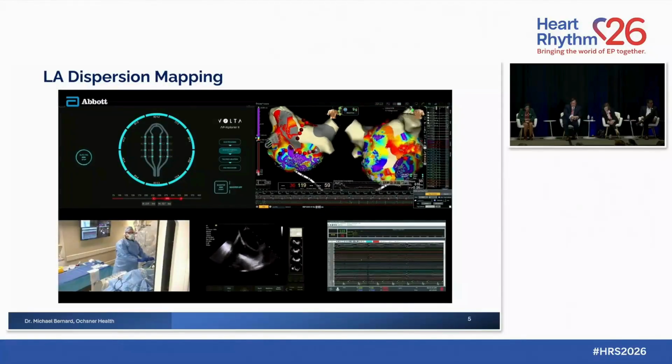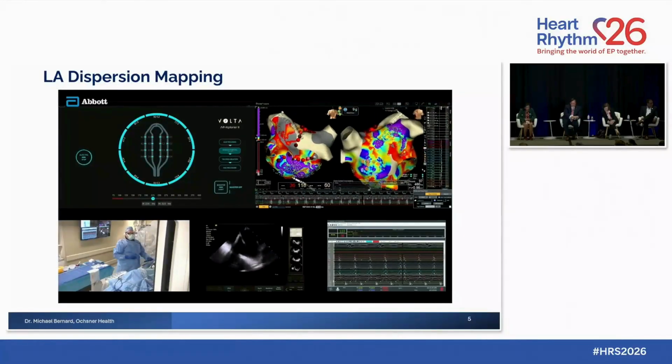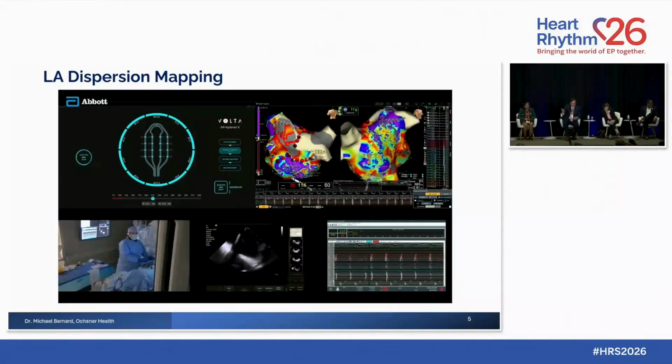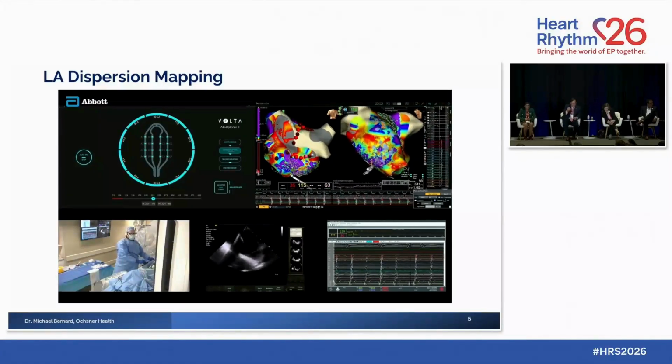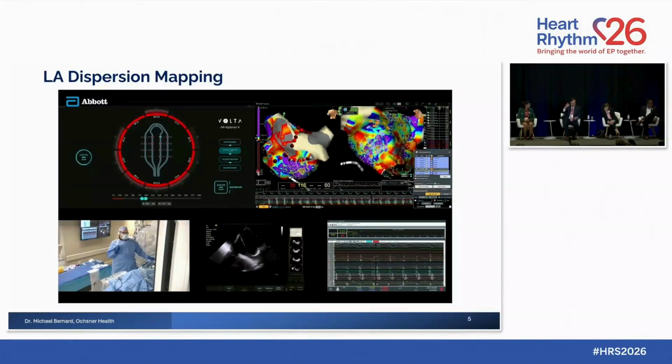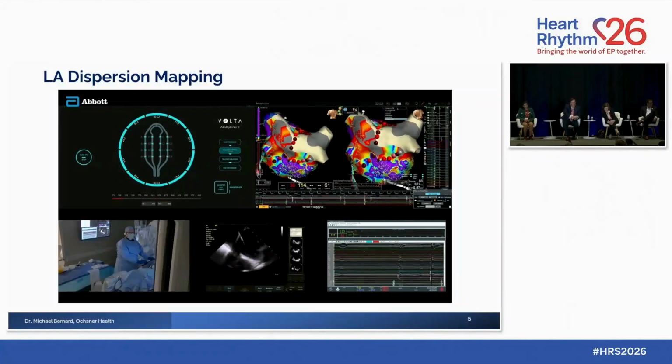And here we come, watch, we come back to the same area. What I really think is amazing is the reproducibility of this. So we come back to the same area shortly. And again, we didn't see any dispersion anywhere else, but here we are again, same area. We reproduced that high dispersion zone.